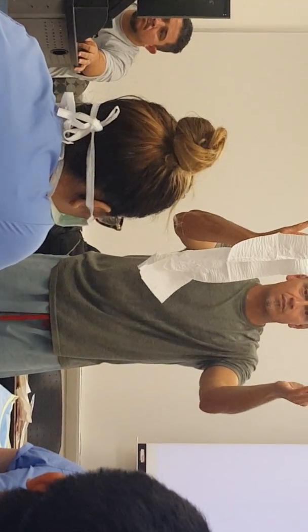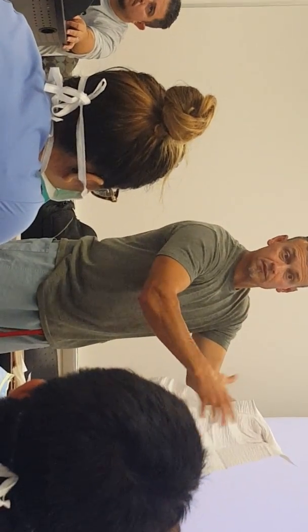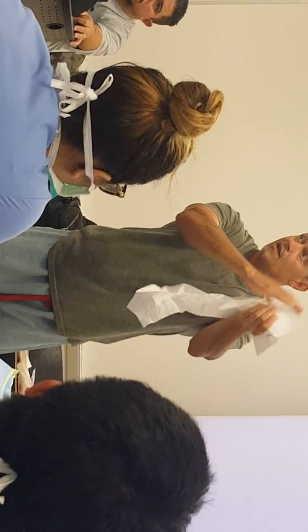Work my way down. Do not work your way back up. Now, what's the next cleanest part? The other half. So do I do this? No. It's always this direction. Got it? Why is that? Because this is the cleanest part now, and it's drying a dirty part. You want the dirty part, dirty part. Make sense? So it has to be handled that way.